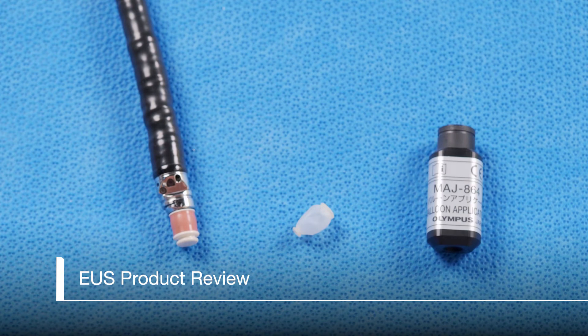Let's review a few features of the tip of the GFUE160AL5 EUS Radial Scope. The salmon colored band is the transducer. There are finely cut crystals under this band, and this area in particular should be handled with care. Here we can see the distal balloon attachment groove and the proximal balloon attachment groove.